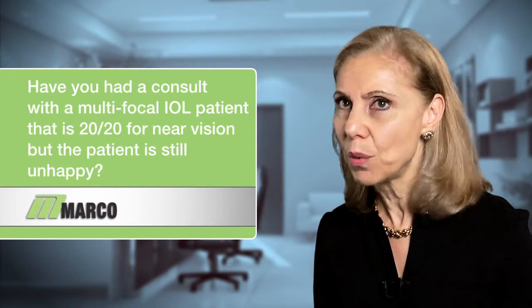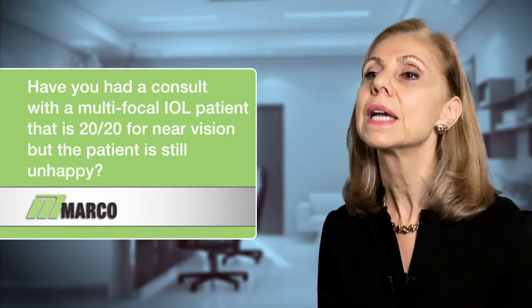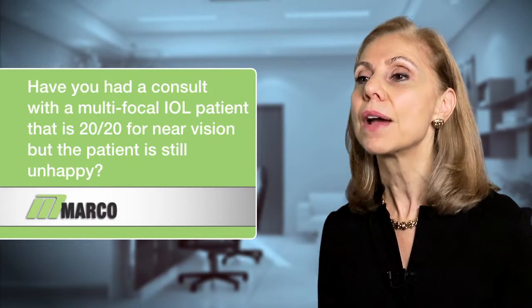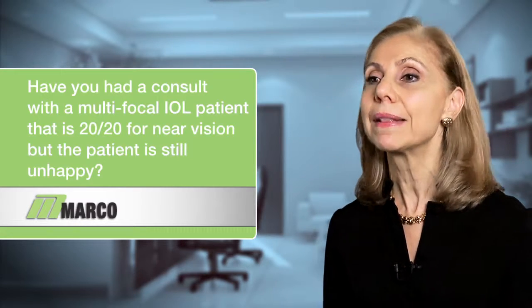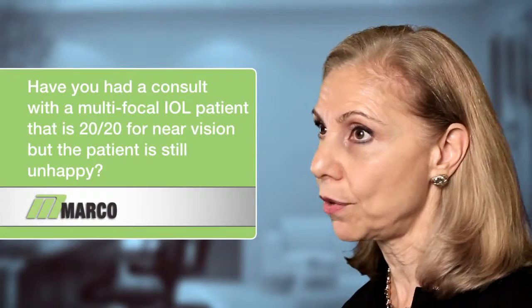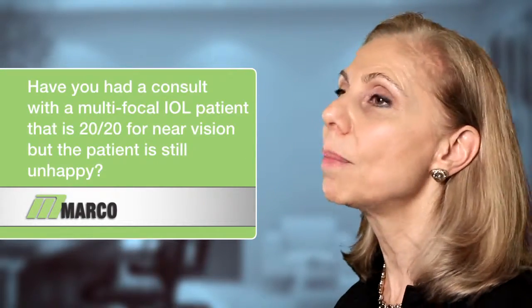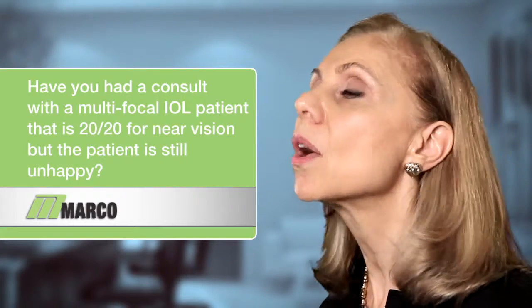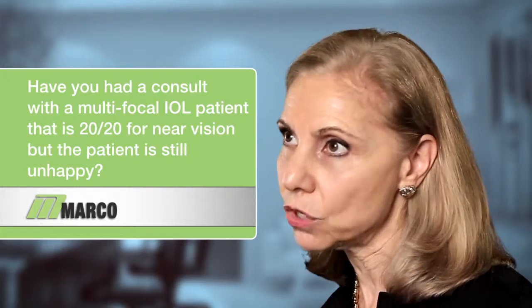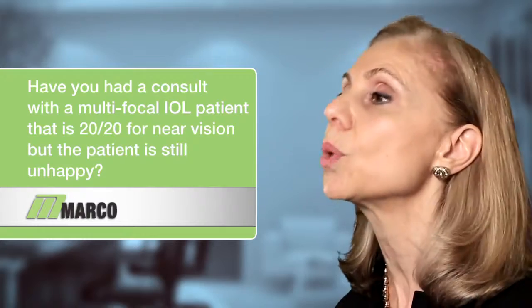So I had to figure out what was going on, and she had come to me for a second opinion. After a variety of testing, including the OPD-3, I realized she had a very large positive angle kappa, which meant that her visual center was different than the anatomical center of her eye, of her pupil. So even though under the slit lamp her multifocal implant was perfectly centered within her pupil, she was having significant issues with night driving.